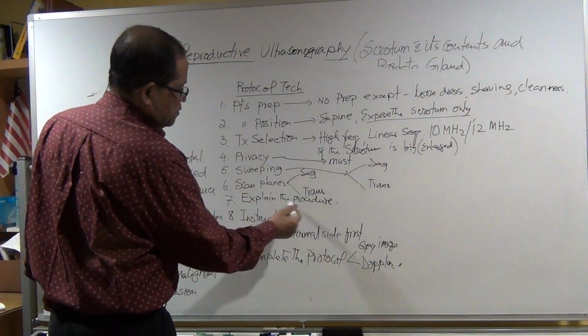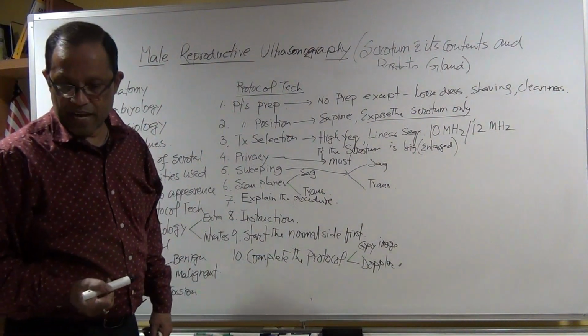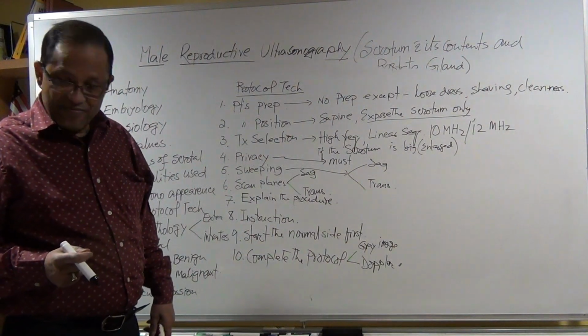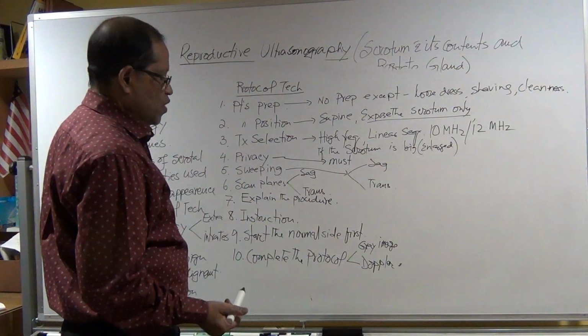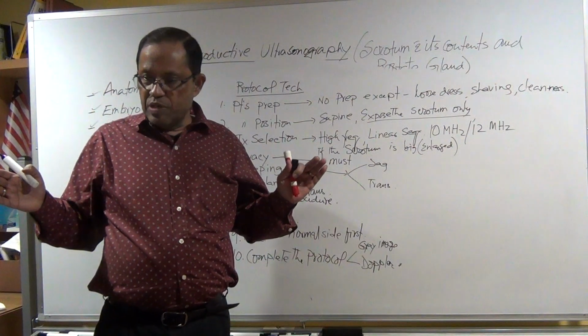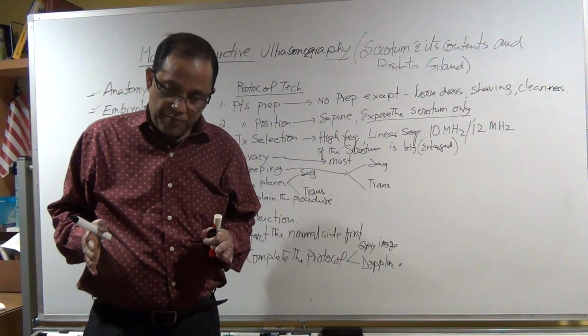Now explain the procedure so that the patient cannot complain, "Oh, I didn't know that you're going to touch me." Make sure. And instruction. What is the instruction? I'm not going to tell you anything because I am not authorized to tell the diagnosis or anything about the exam.